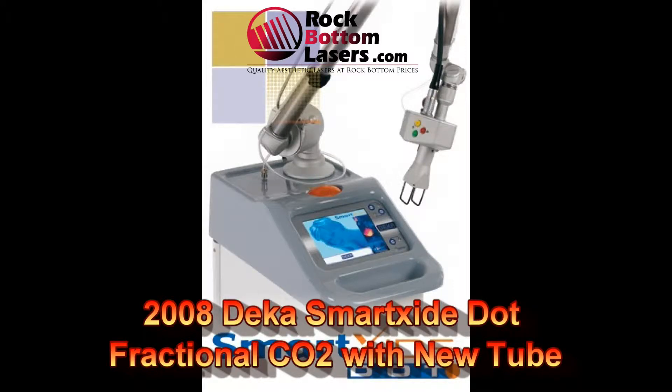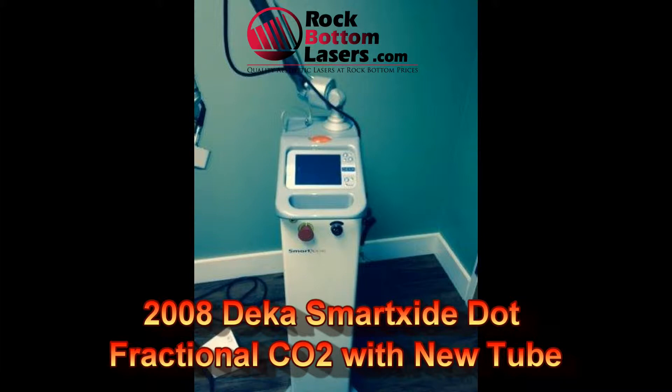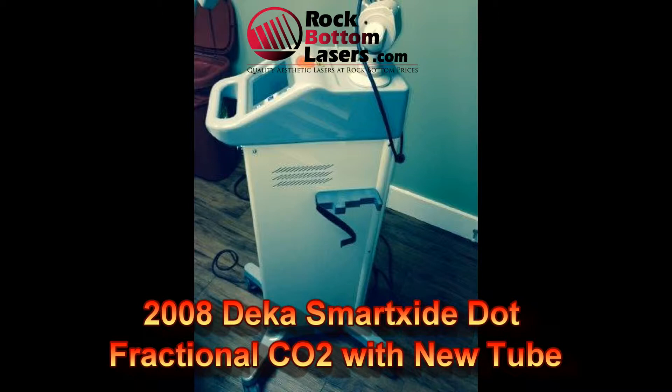Hi folks, this is Vin Wells with rockbottomlasers.com and what I'm featuring today is a 2008 DEKA SmartXide fractional CO2. What makes this particular unit unique is that it does come with a new CO2 tube and preventive maintenance prior to delivery to your clinic.